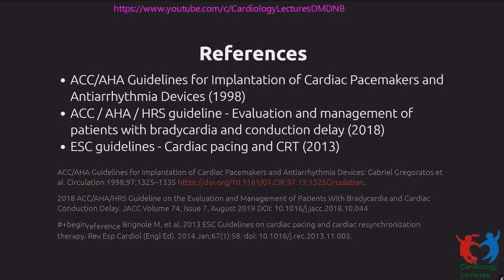Then an option is to do an ILR implantation. ILR is very good in this setting. You implant an ILR 3-4 months back. If the patient has an episode of syncope, you can go back and see what the syncope was due to. If syncope clearly happened but there was no AV block, it's some other reason, and you can evaluate for that. Whereas if AV block happened, you can pace them. So that would be the way I would look at this.